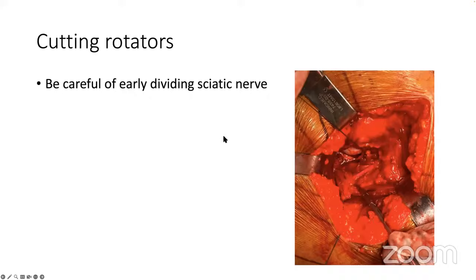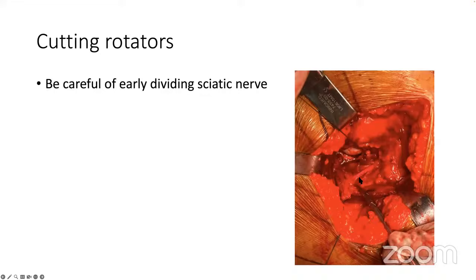Be mindful when cutting the rotators. This is an unusual situation where the sciatic nerve is divided early — the smaller division and the bigger division — with the nerve piercing the piriformis here. In such cases when you cut the rotators, you can damage the sciatic nerve. This is an uncommon situation, but something to be careful about. Always palpate the nerve and when retracting the piriformis, look for this abnormal sciatic nerve division, which can lead to sciatic nerve palsy if not recognized.